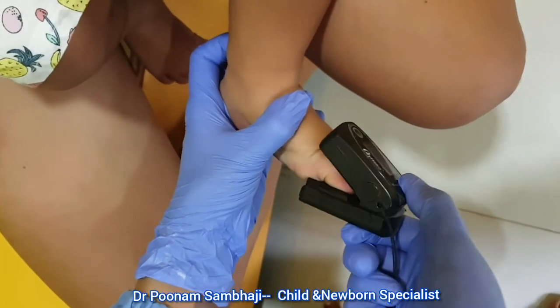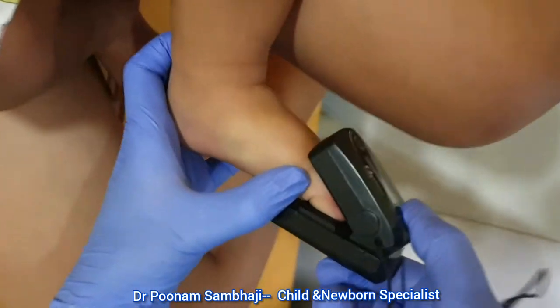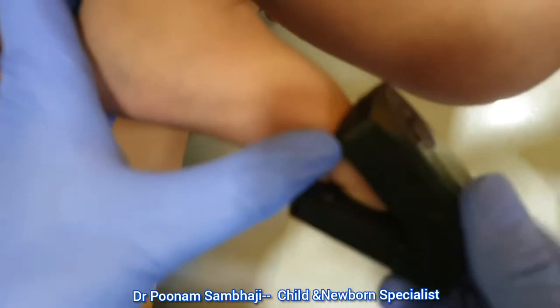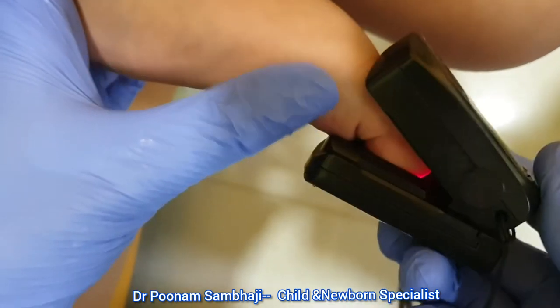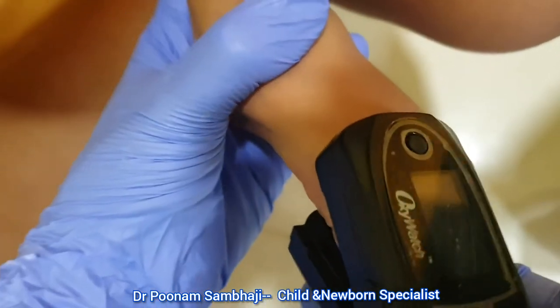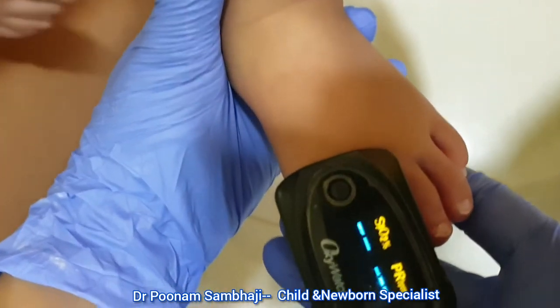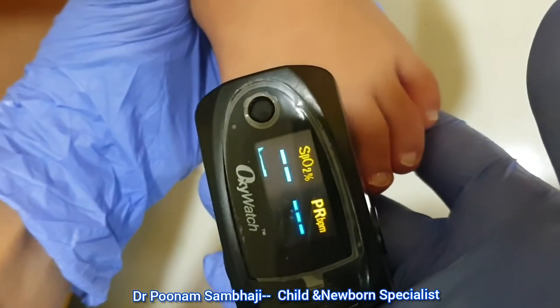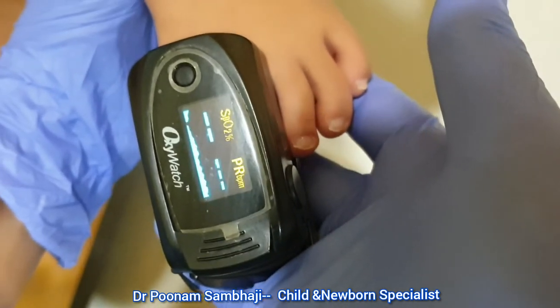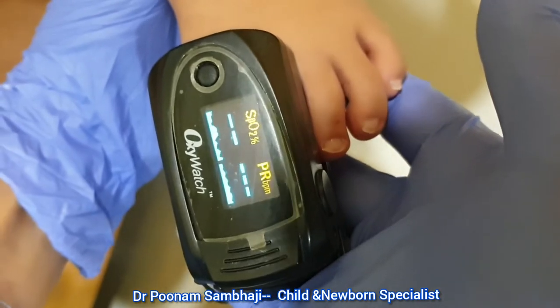Now in babies you can even use the toe, for that matter even in adults you can use the toe, provided the toe is clean. The toe should reach till the sensor. Once you put it on, you see that red sensor, the toe should be reaching that sensor, so it should be placed on that light. Put on the pulse ox and read the readings that will come on the screen. Remember, a baby's pulse rate is higher than an adult's and goes on changing according to the age group of the baby.